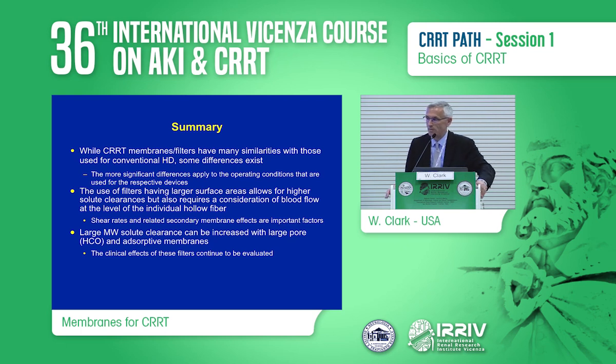So to summarize then, Mr. Chairman, while CRRT membranes and filters have many similarities with those used for conventional hemodialysis, some, I would say nowadays, nuanced differences may exist. But really the differences apply to how they're being used and the operating conditions, flow rates, and so on in which they're being used.